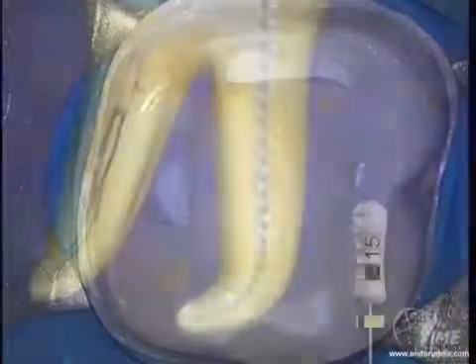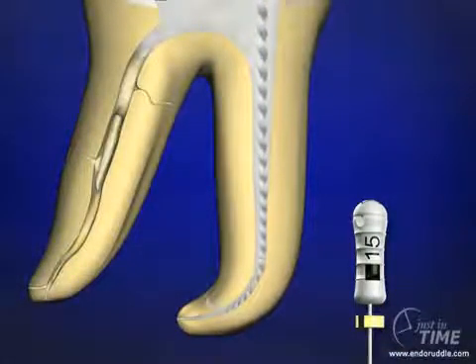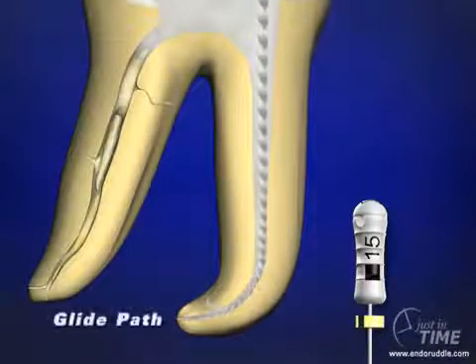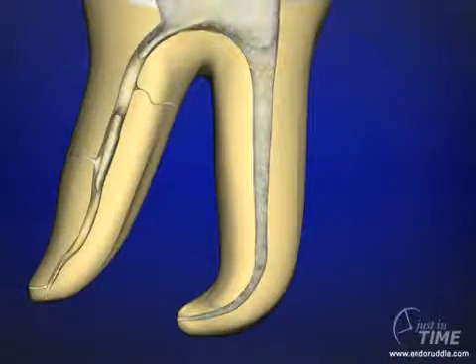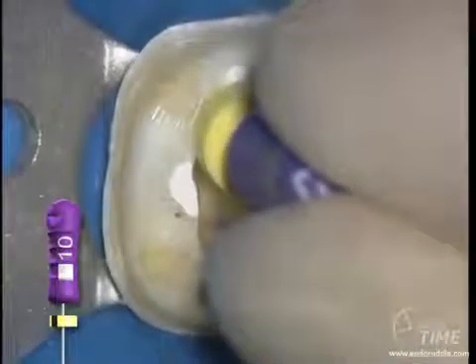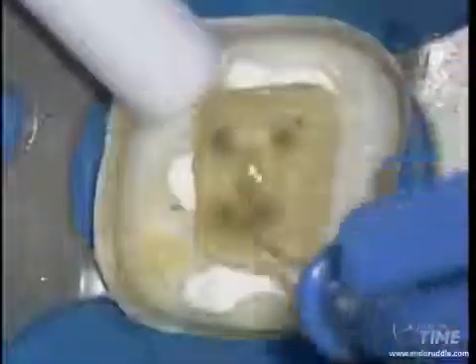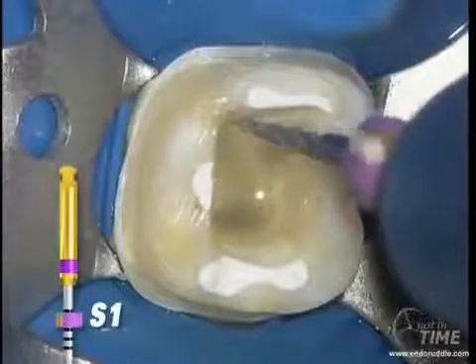Since we've never been in the apical third, we want to put in a viscous chelator and, through a little bit of effort, carry first a 10 and then a 15 to length. Once we have a known working length in a patent canal, we check the glide path. When we check for the glide path, we never reciprocate the handle of the instrument — we just see if the instrument will slip and slide over a range of 3 to 5 millimeters. Even checking the glide path can create dentinal debris, so it's good to recapitulate and re-irrigate to ensure a preferable pilot hole for the tip of the rotary instrument to follow.